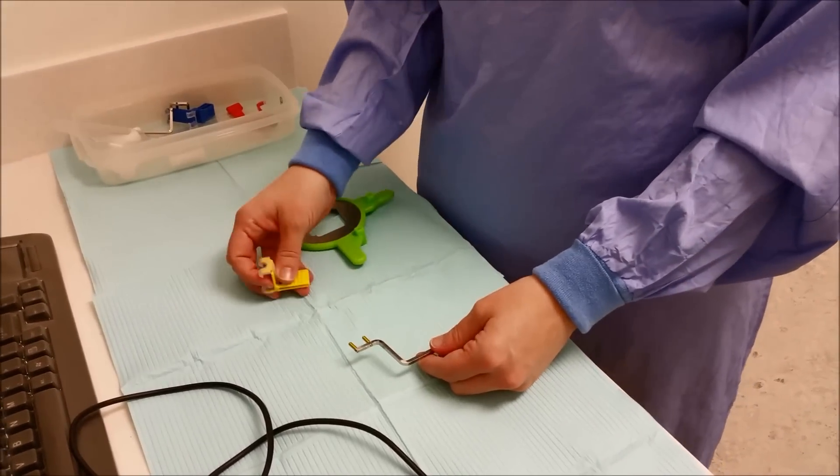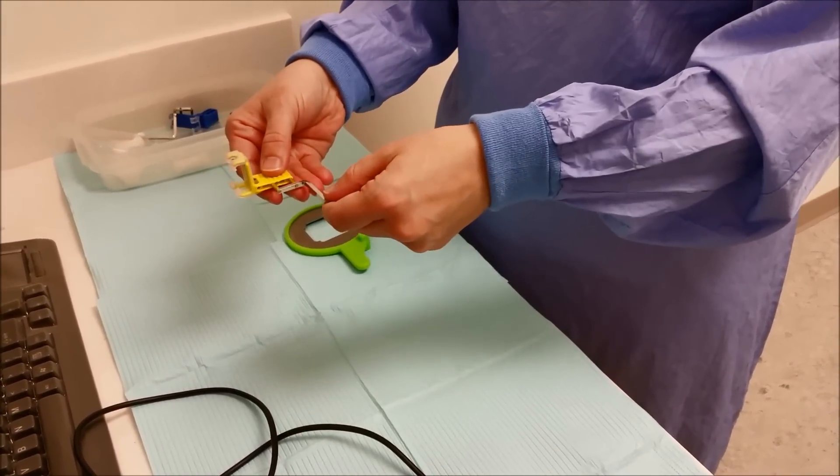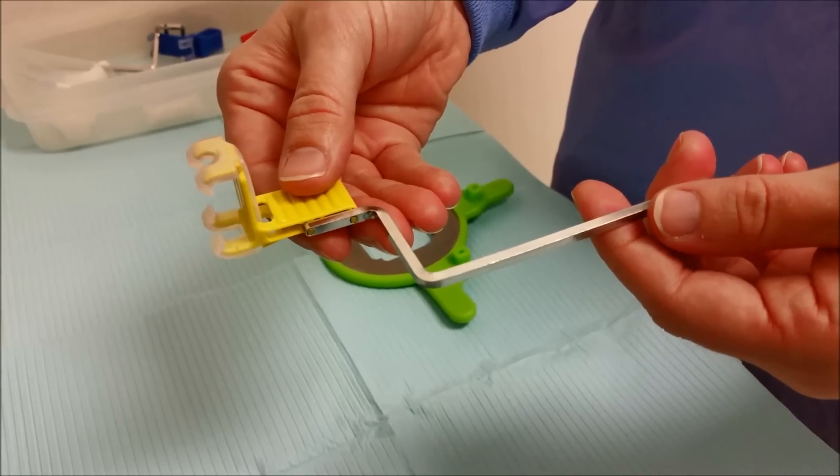Depending on which arch you are going to be using, you will decide on where to put the bar and the bite block. We're going to start with the maxillary left premolar.